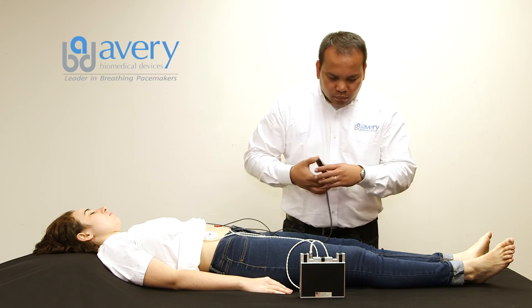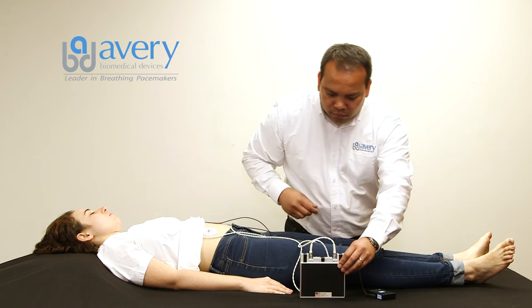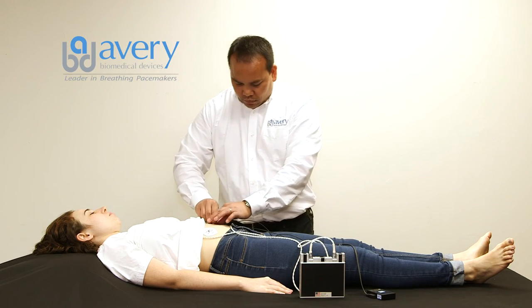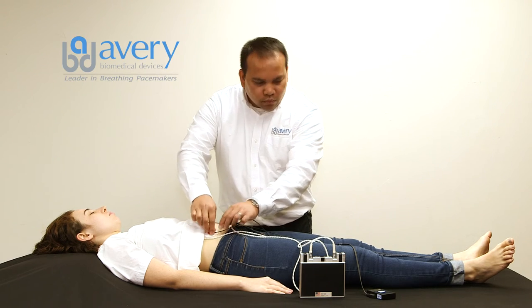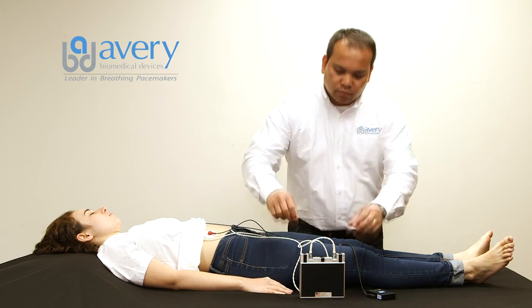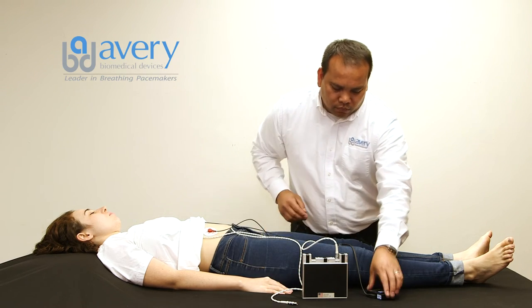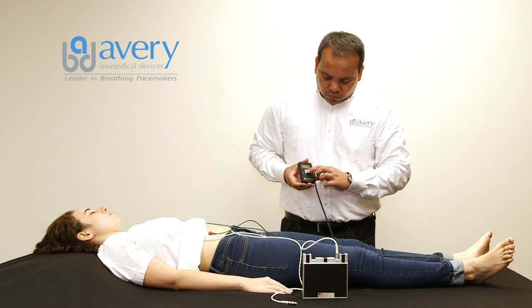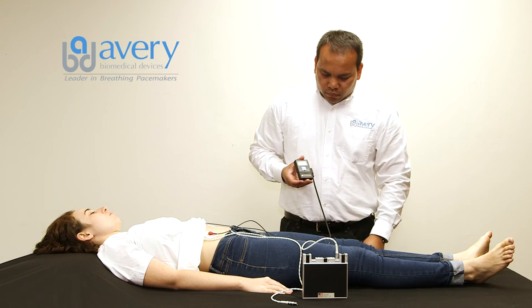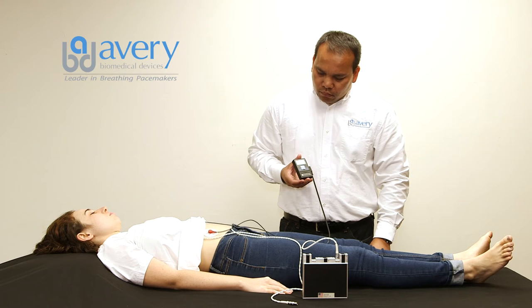Reconnect the right side antenna to the pacemaker transmitter. Disconnect the red snap button from the left skin electrode and connect it to the right skin electrode. Disconnect the left side antenna from the pacemaker transmitter while keeping both sides of the transmitter turned on. Press one of the record/send buttons for two seconds until a continuous audible tone is heard, and then release it. The recording takes 30 seconds. Once the recording ends, a warble beep will be heard.